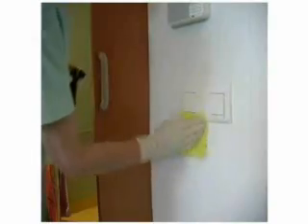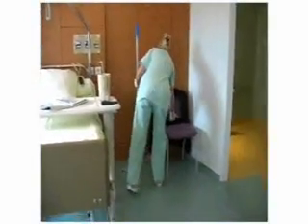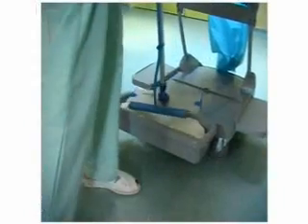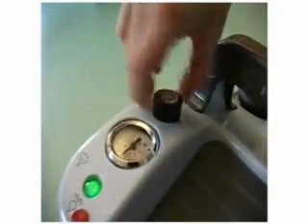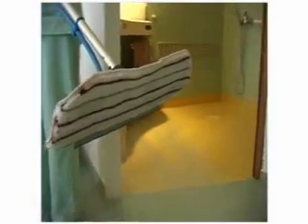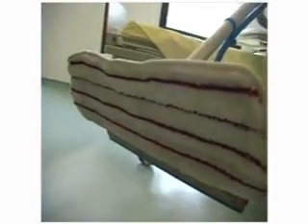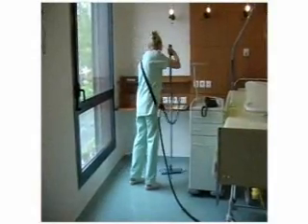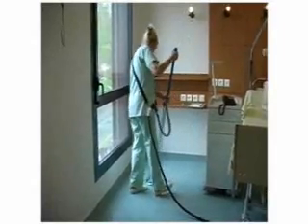Waste must be removed and the surfaces of the patient's furniture wet wiped with a wipe moistened with the appropriate chemical. The room floor is then treated with a steam brush, where a microfiber washcloth for the adapted long or short-term use is attached. This washcloth must be changed for each room and put into the appropriate dirty linen basket.